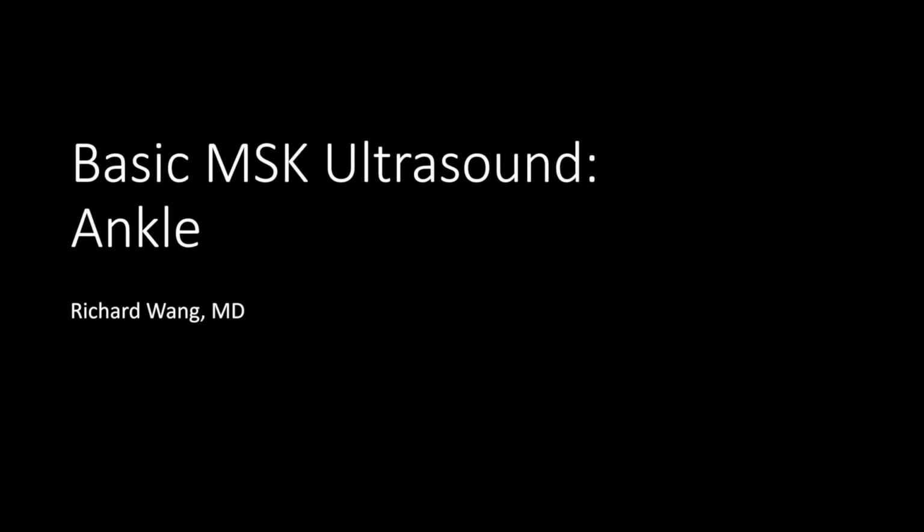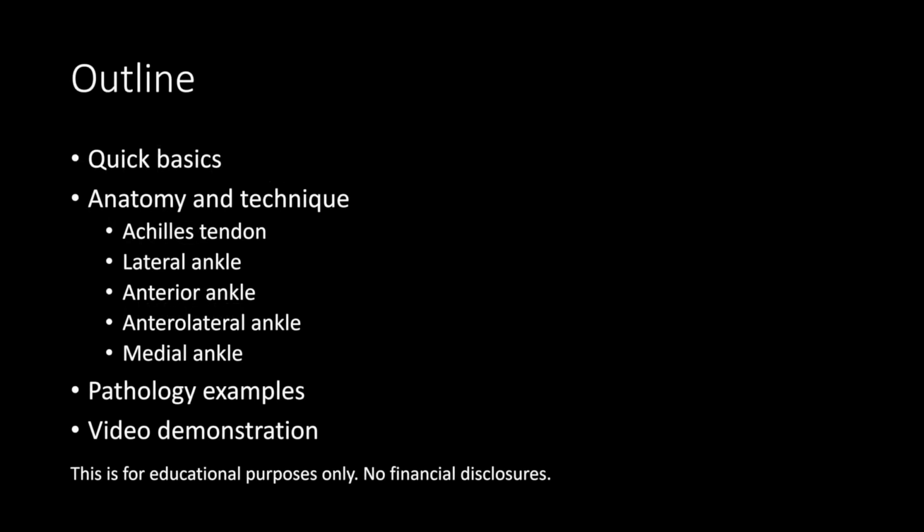Hey, this is Richard Wang, one of the radiology residents. I'll be going over basic MSK ultrasound evaluation of the ankle today. First, I'll go over some ultrasound basics, and then I'll go over the anatomy and technique for parts of the ankle, and then the pathology, and finally end on a video demonstration.